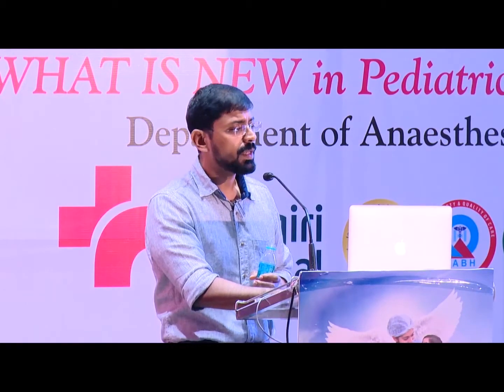Over the course of the day, his abdominal distension increases further. The blood gas done 4 hours later shows improvement. The pH is 7.35, the PCO2 is 32, the PO2 is 88, bicarb is 18.2, and his lactate is still high at 5.8. He is sedated. Therefore, we decide, because the CO2 has come down, to decrease the rate to 45, and the oxygen is also weaned. Serial X-rays are done primarily to rule out perforation.